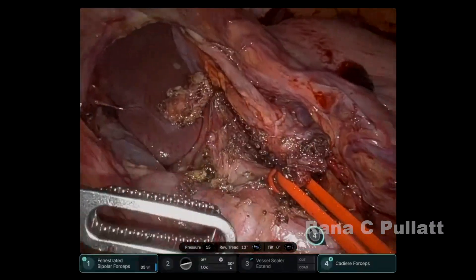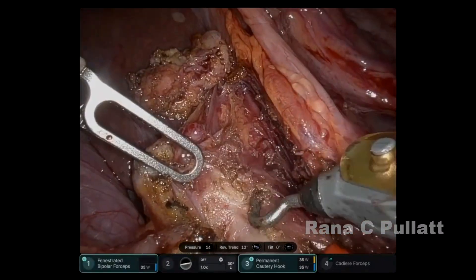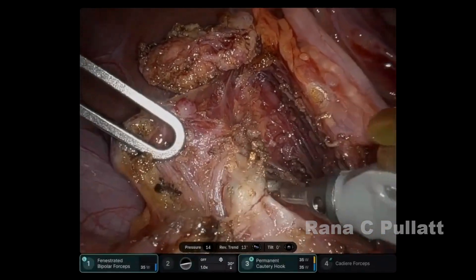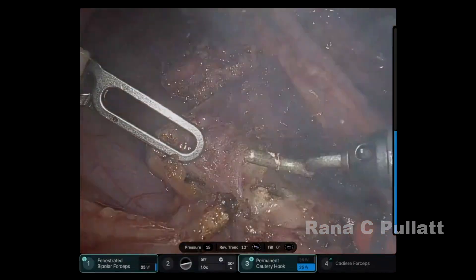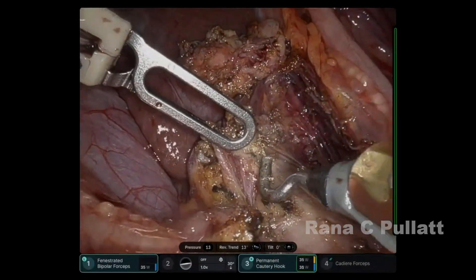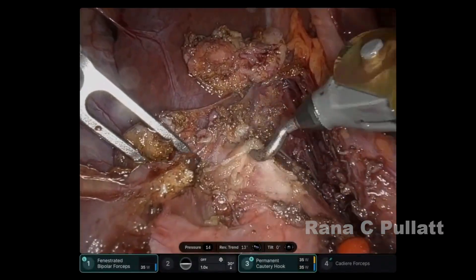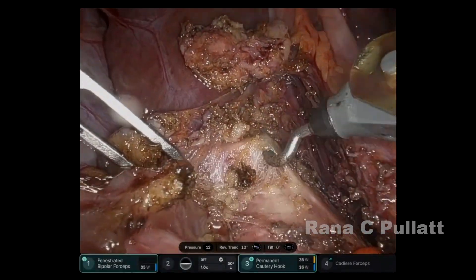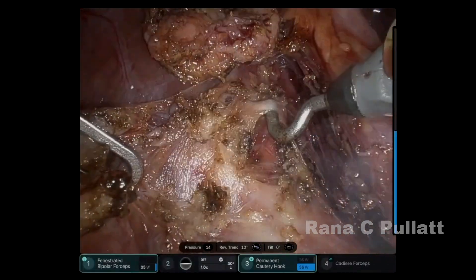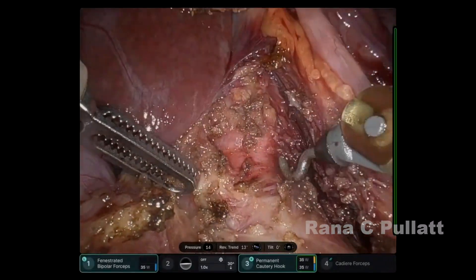The left gastric artery is then looped and traction is applied. We then proceed to identify the remaining nerve fibers around the celiac artery, and these are all progressively removed to expose the diaphragmatic fibers that overlie the celiac artery. The celiac artery dissection is coming into view at this point.